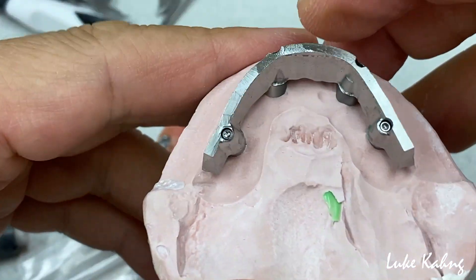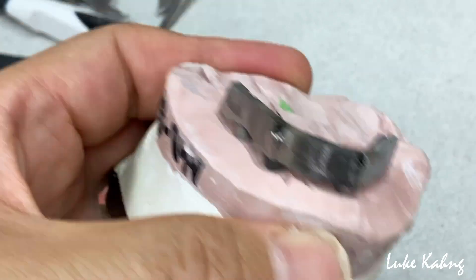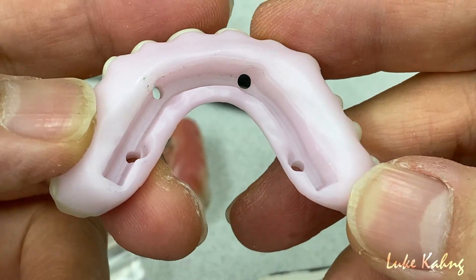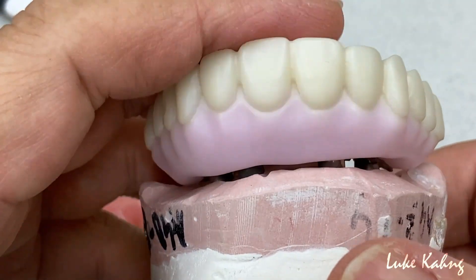This is another great option. We mill here — we made Ti-base along with the hybrid bar, and then this is a specific design underneath. And then we can cement them together. They will never fail Ti-base.